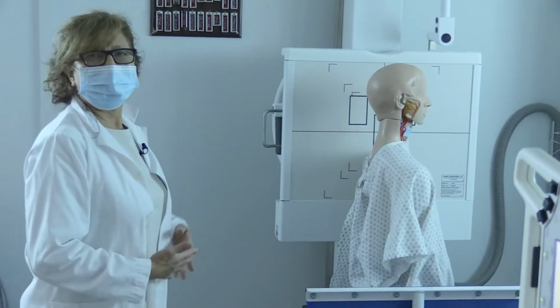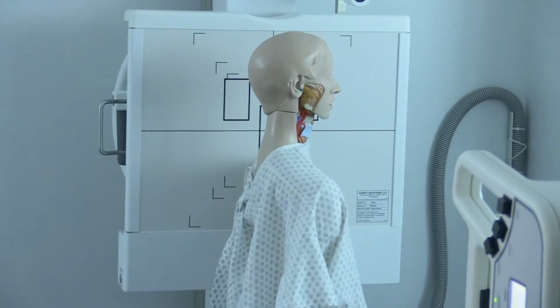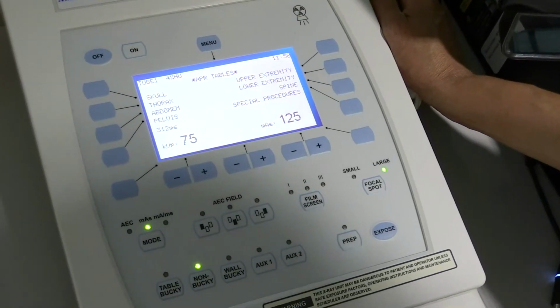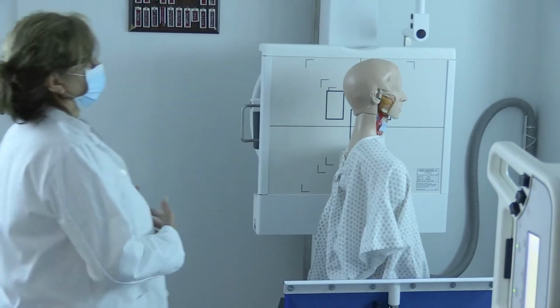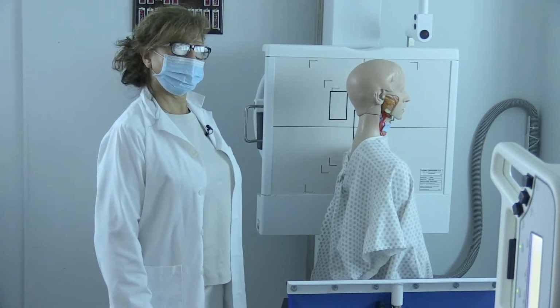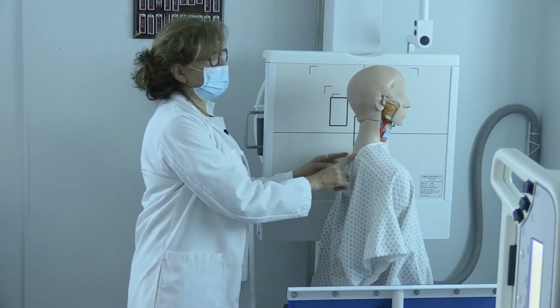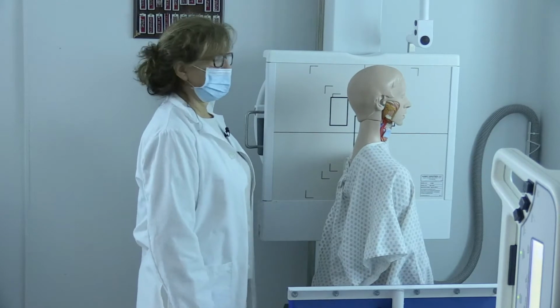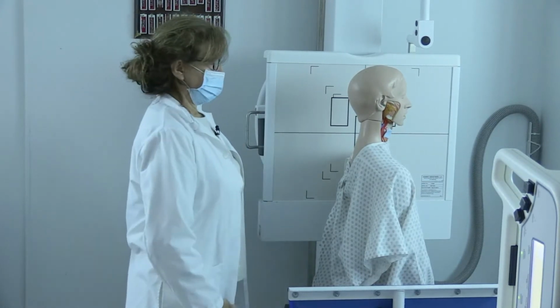And then I'm going to ask the patient to take a deep breath in, blow it all the way out, and hold their breath. And they can breathe. Asking them to hold the breath on expiration further lowers the shoulders down so that we can see the lower cervical spine. If a patient's unable to depress their shoulders enough, you can also put weights around their wrists.